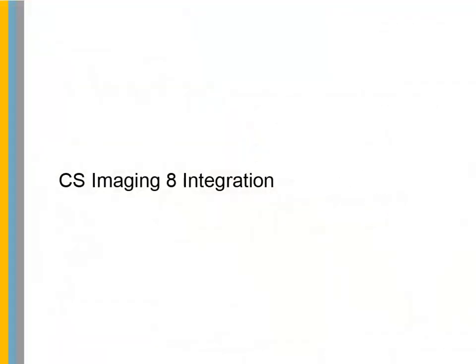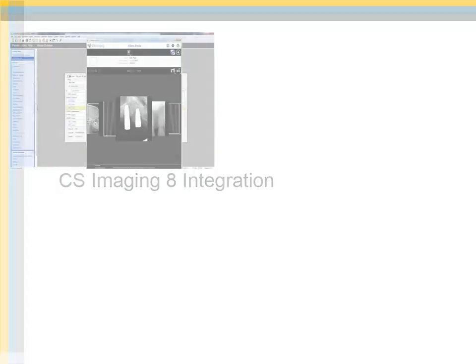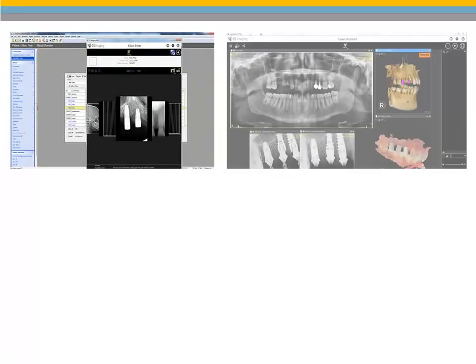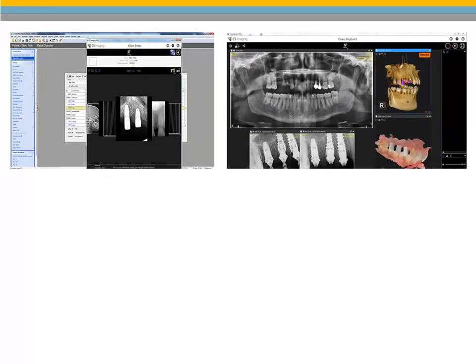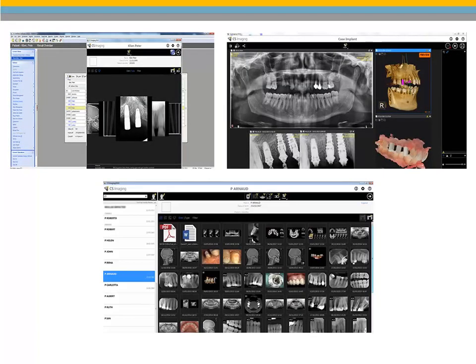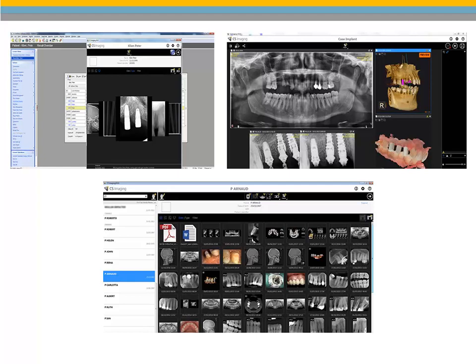CS Imaging 8 Integration. This version of Softdent includes the integration of CareStream Dental's newest imaging software, CS Imaging 8. Updates to the imaging platform provide one-stop access to all of your 2D images, 3D images, and CAD CAM data.